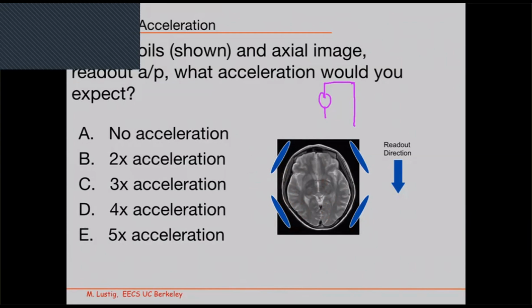So yeah, you're right in that sense: while I have 4 coils, I can combine these 2 together and these 2 together and say, yeah, they vary, but this one doesn't vary as much as that one along this direction. So I have 2 effective coils approximately. Of course, you need to really analyze it, but technicians actually do that.